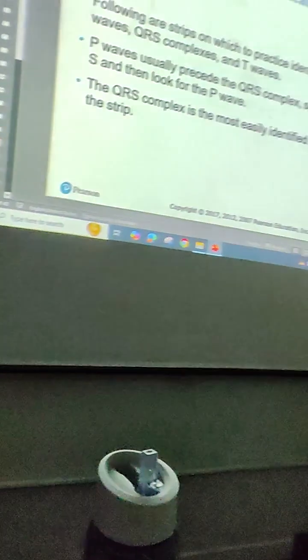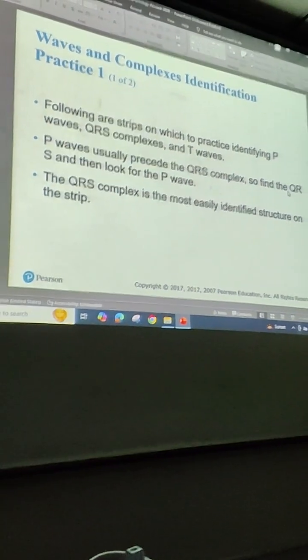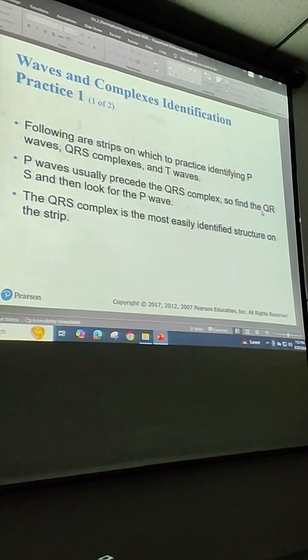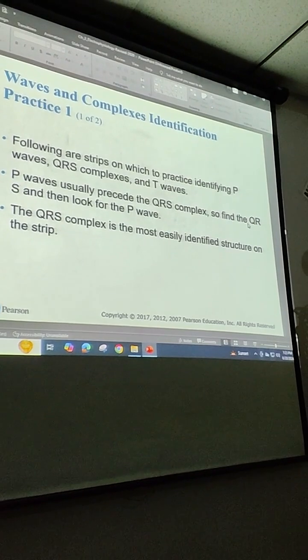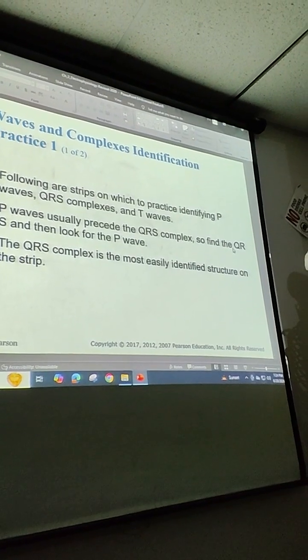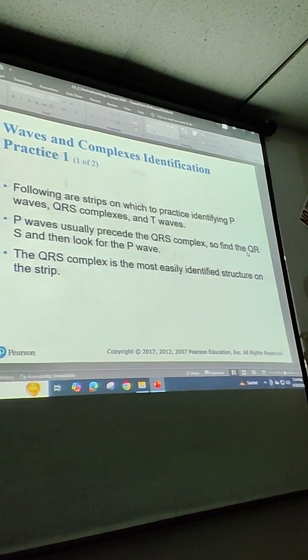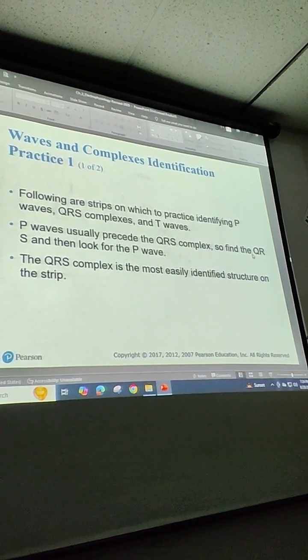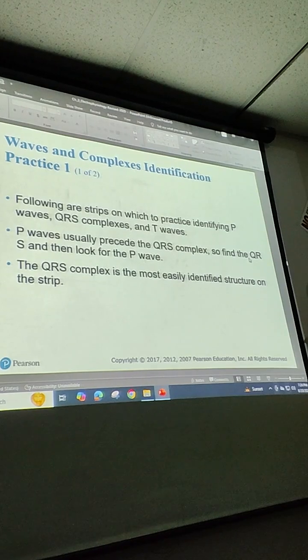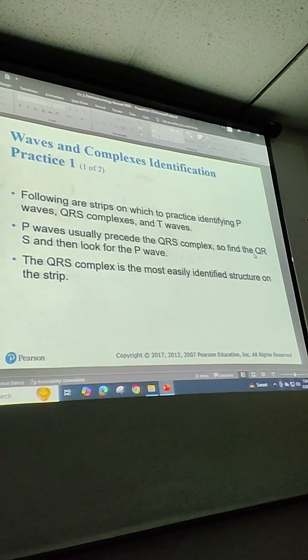Once again, pay attention to this in order for us to know immediately, as soon as you see an EKG, check for all the components on the EKG. If you see all of them in order, P wave, QRS, T wave, next. P wave, QRS, it doesn't matter how they look, it's just that they're present.